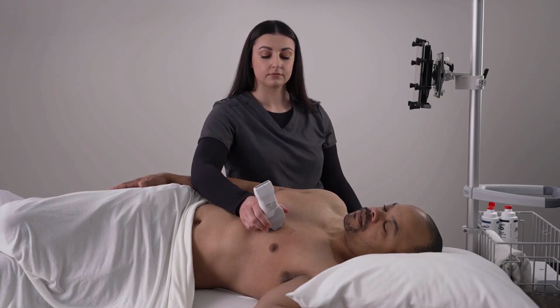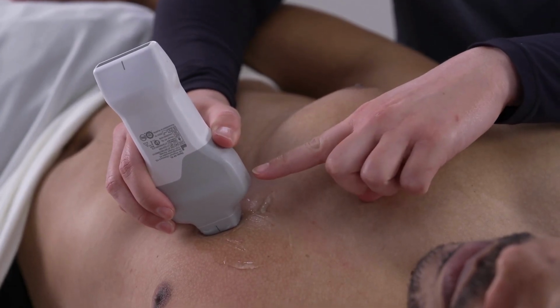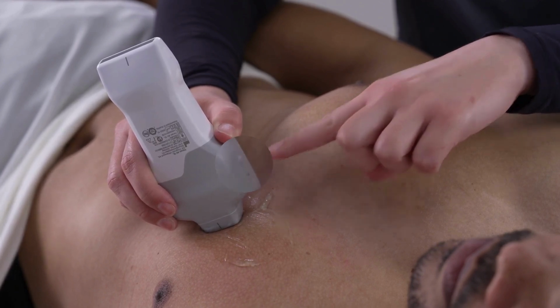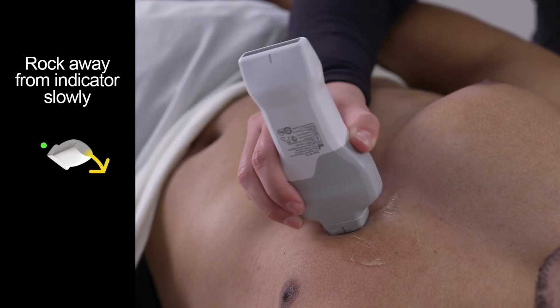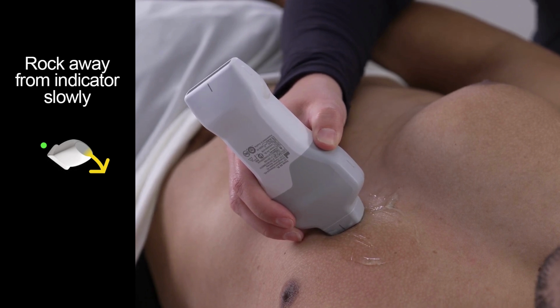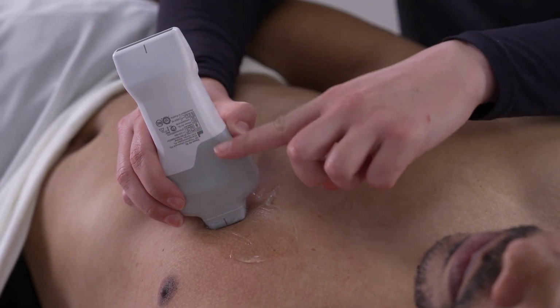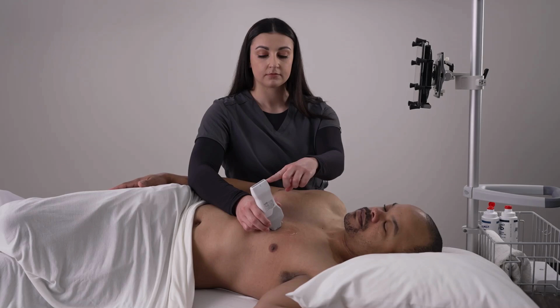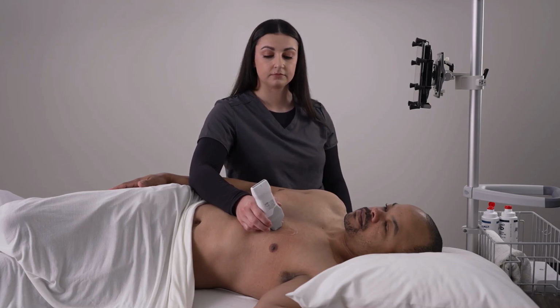Rocking and tailing are both angling movements and are performed along different axes of the probe. Rocking refers to movements performed along the indicator axis. Since the indicator is only on one side of the probe, the directions for rocking will be to rock towards the indicator, or to rock away from the indicator. Tailing is the second angling movement that is performed along the non-indicator axis. The tail also refers to the end of the probe. You can make tailing movements in 4 different directions, depending on the view you are trying to acquire.